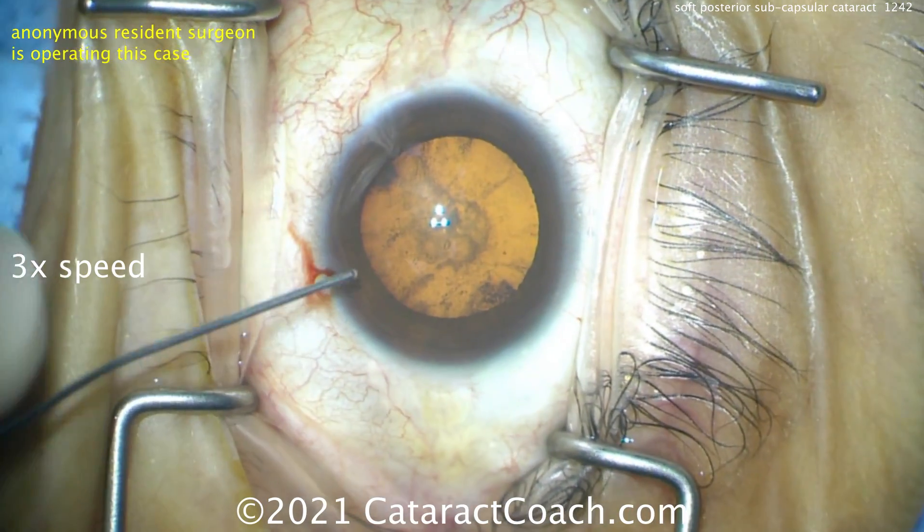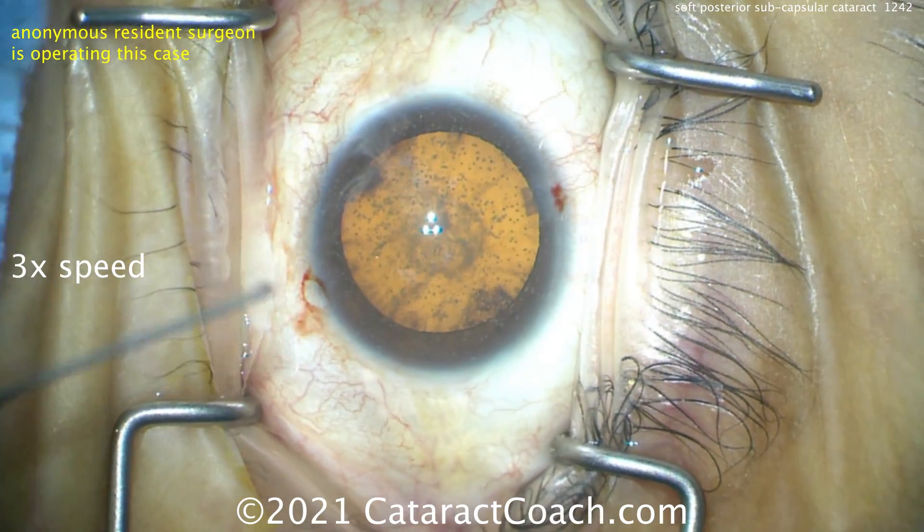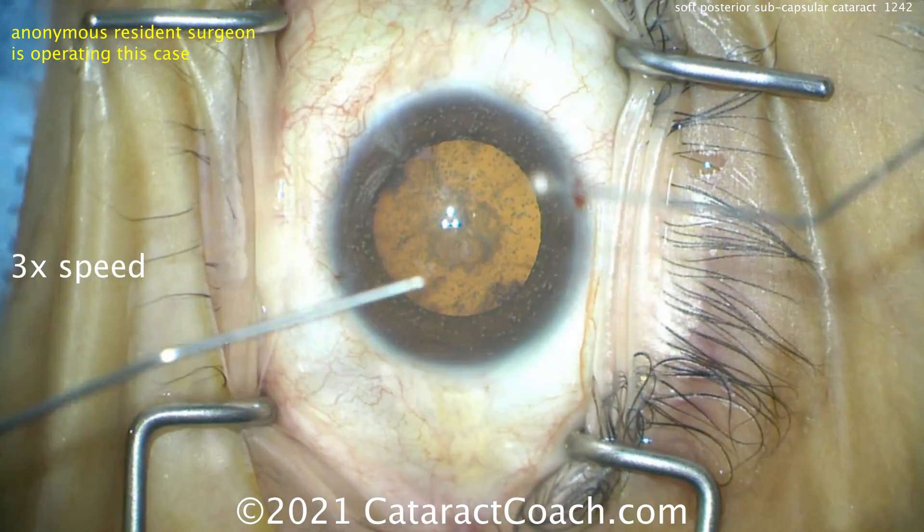Here comes the dispersive viscoelastic going inside the eye. I'm going to make an extra paracentesis right there just so I can help if need be, and deepen up the anterior chamber a little bit.